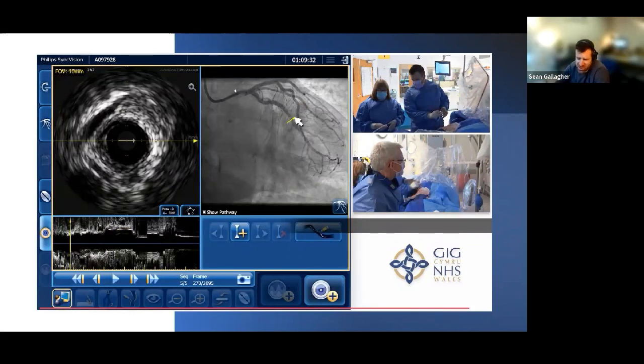The hardest situation you get into, I think, in left main PCI is losing wire position with a stent that's not been optimized in the shaft of the left main, because getting back through the stent can often be a nightmare. And the other worry is damaging the front end of the stent with the guide. So if you POT as the first thing you do, you can take those potential catastrophes off the table early on.